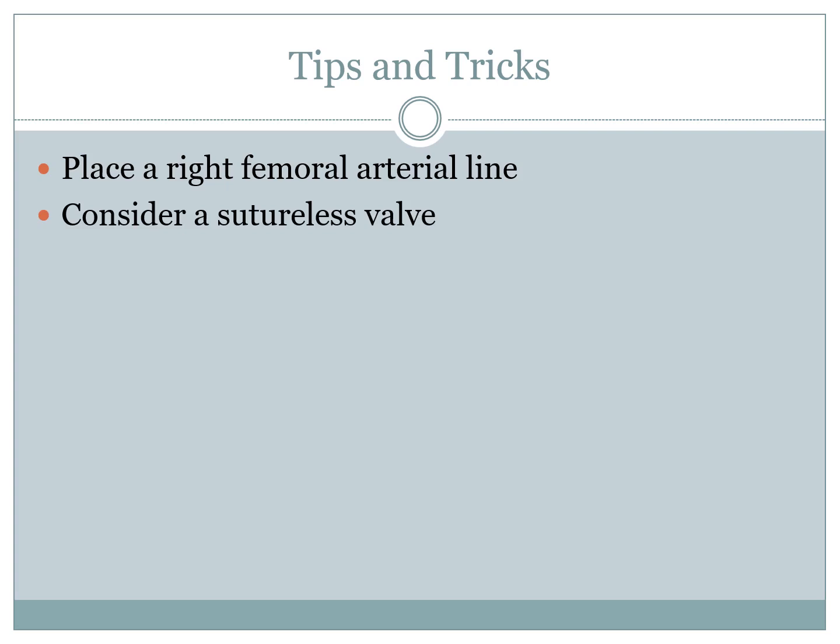For a redo aortic valve, I'll always consider using a sutureless valve depending on the condition of the root. It's particularly valuable if you're doing something like a redo Freestyle bioprosthetic aortic root, which is typically very calcified, and you would have to take out that aortic root. You would have to salvage your buttons off the Freestyle without injuring them. Then you would have to do a full root replacement and reanastomose your coronary arteries.